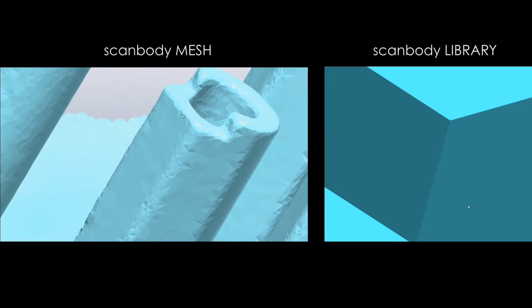We don't have a sharp situation in this file, because it's a mesh, it's an approximation. It's very important to keep in mind. The dental technician changed this mesh, the mesh of the scan body, with the library file, and then we obtain a hybrid file, because the dental technician modeled the final restoration or the provisional restoration on the library components that are inserted in a mesh, so the arch.